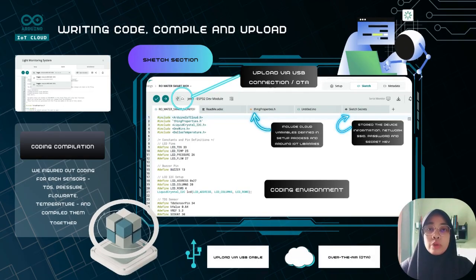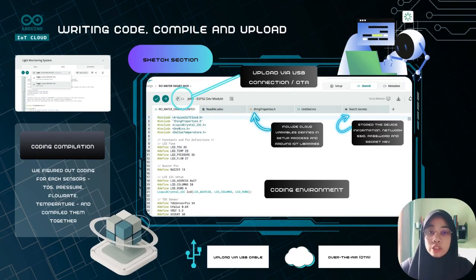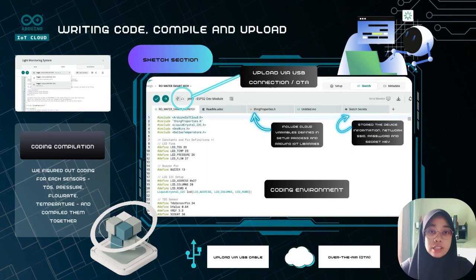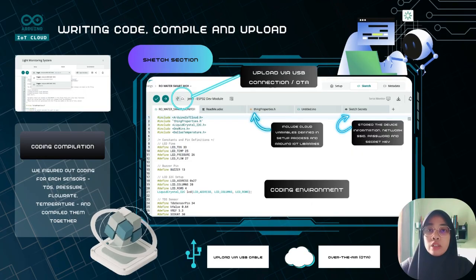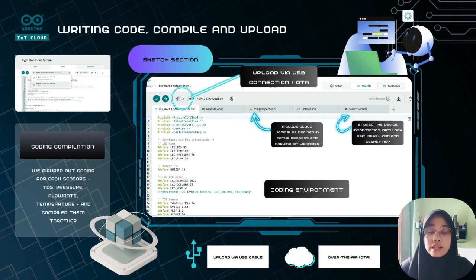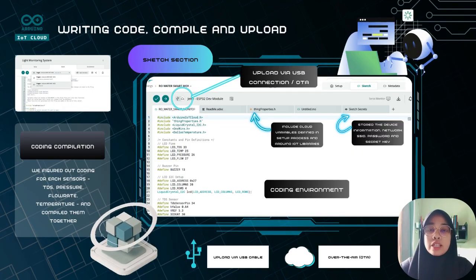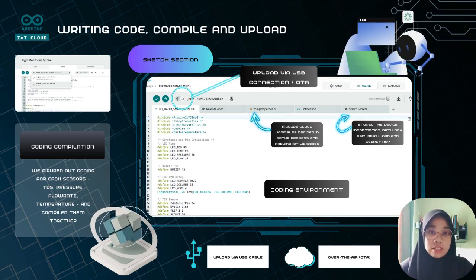For software development, we use the Sketch section in Arduino IoT Cloud to write, edit, and manage our project code. This section allows us to define constants, configure the sensor pins, and implement the logic for data collection and alerts. Once written, the code was verified, compiled, and uploaded directly to the ESP32 via USB connection. Another advantage of using Arduino IoT Cloud is its over-the-air function, or OTA. This function allowed us to upload the code remotely without requiring a physical USB connection to the ESP32, making maintenance much more convenient for us.